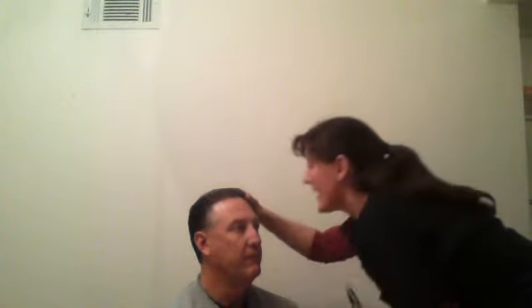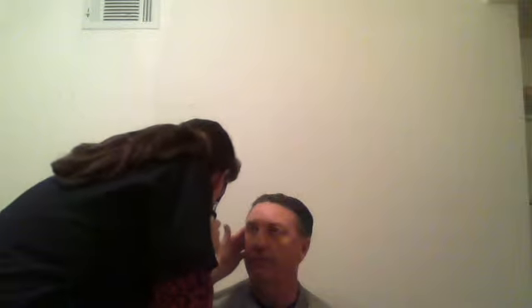Okay. What I want you to do, I'm going to turn this way. I'm going to look in your left eye first, and I need you to just look over my shoulder, looking for the red reflex. There it is. And I'm going to move in. Okay, that looks good. I'm going to move over to the right eye. The red reflex. Okay. Now I'm going to move in. And that looks normal there.